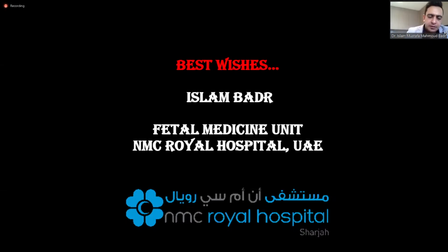But when the case is high risk, you can send the case for something called fetal echocardiography, and this is my second message. The cases of high risk can go immediately to do the fetal echocardiography. And maybe the most frequent high-risk patients are those who go for the basic cardiac screen, but something turns out to be abnormal. This is when the case is transferred from a low-risk patient to a high-risk patient. Then she should go to the fetal echocardiography. So my message: fetal cardiac screening for all pregnant women, because the vast majority of congenital cardiac malformations come from low-risk patients. The second message is that high-risk patients can go to a service called fetal echocardiography, where a more advanced fetal cardiac examination is done.